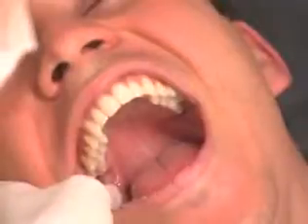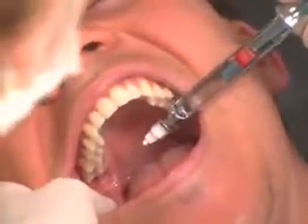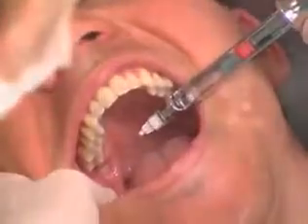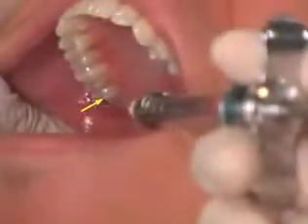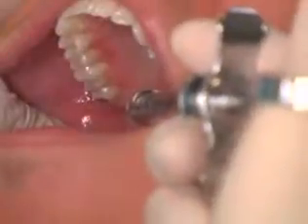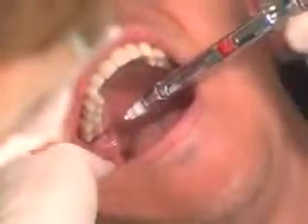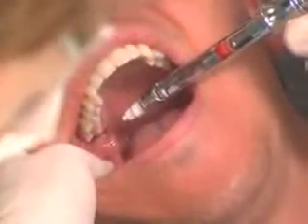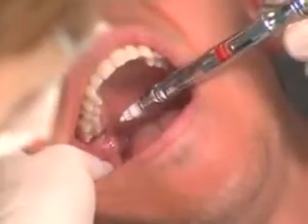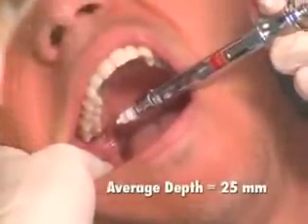The barrel of the syringe is placed in the corner of the mouth on the opposite side, and the needle tip is placed just below the mesiolingual cusp of the maxillary second molar. And then the needle tip is moved just distal to the second molar. This locates the insertion site for the Gow-Gates injection. The needle is now inserted until bone is contacted. The average depth of penetration in a Gow-Gates injection is approximately 25 millimeters.